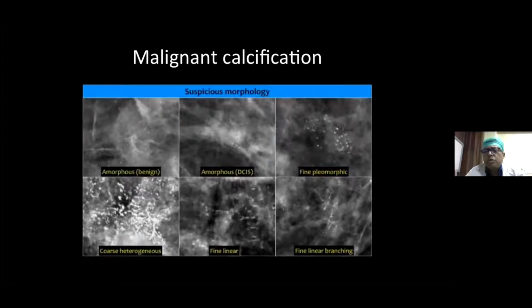During the exams, you are asked what is a typical microcalcification of malignancy. Mark my word, it is said it is a pleomorphic calcification. That means every single calcification is different from the other. It has to be more than 5 dots within a 1 square centimeter area. So pleomorphism, number, and within 1 square centimeter is something which is classically a clustered microcalcification of malignancy.